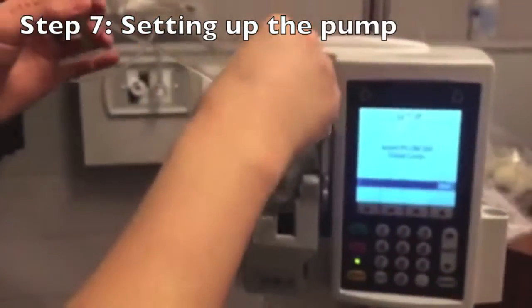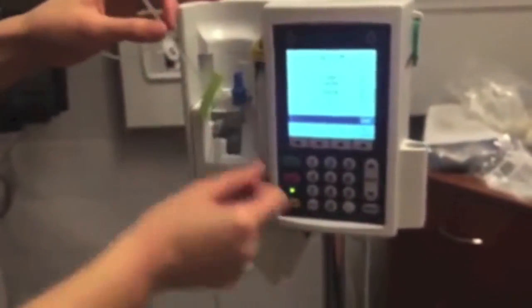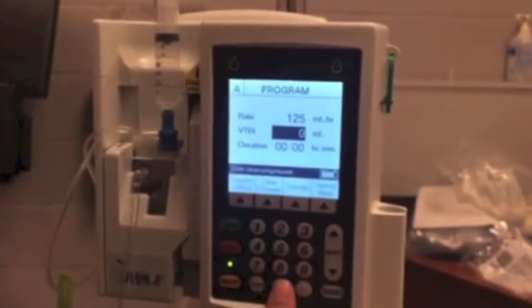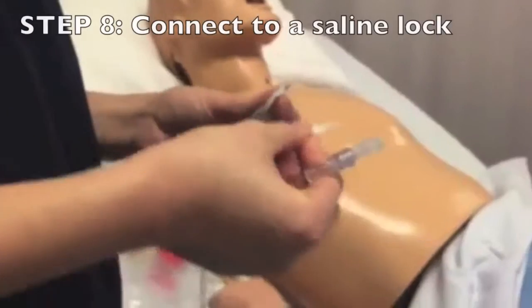Infusion pumps move fluid by compressing and milking the intravenous tube. The rate control clamp should be open completely while the infusion controller or pump is in use. It is important to maintain asepsis of the catheter hub. Before connecting, clean it with an alcohol swab.